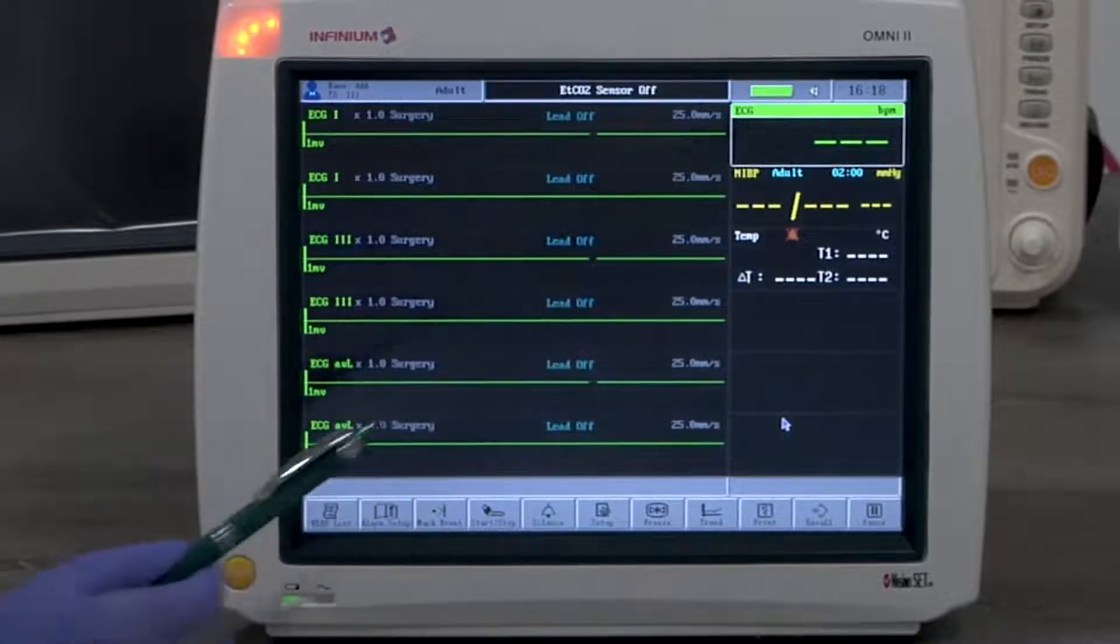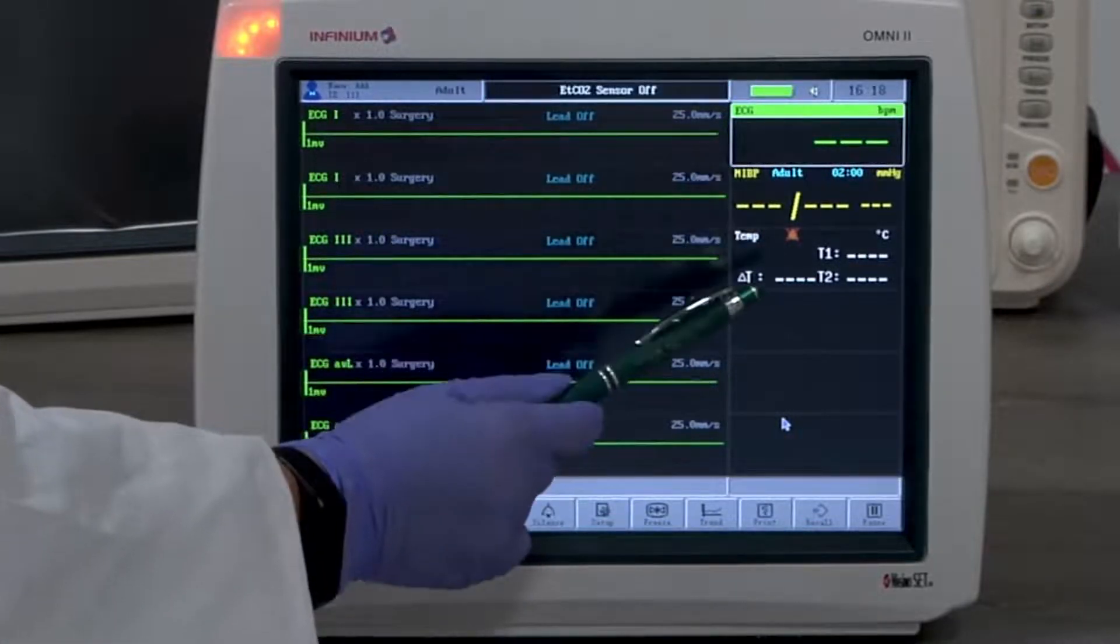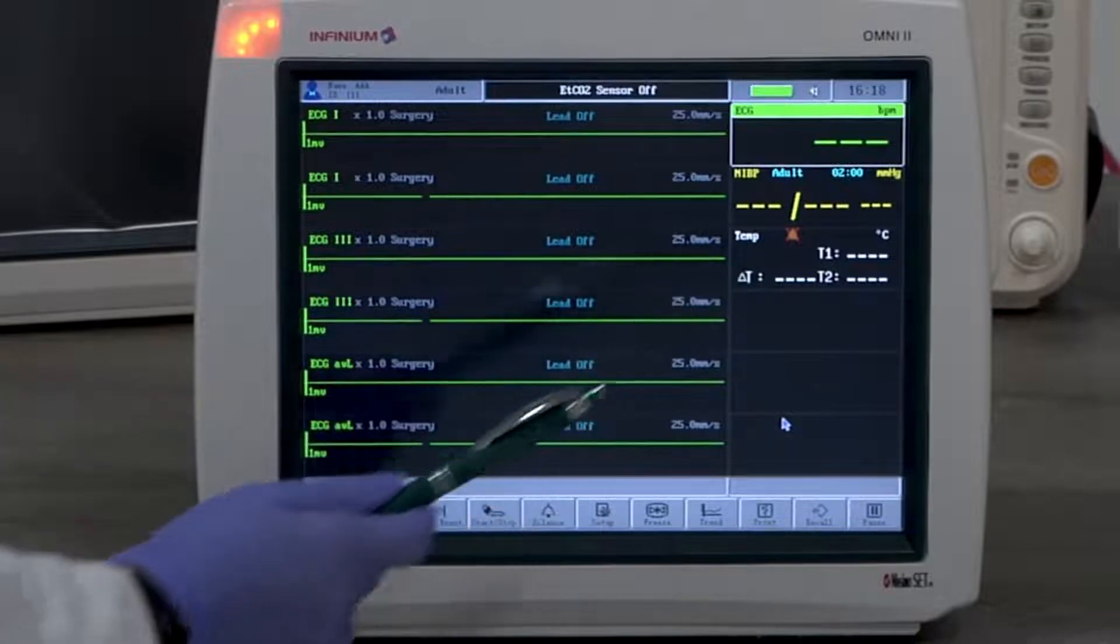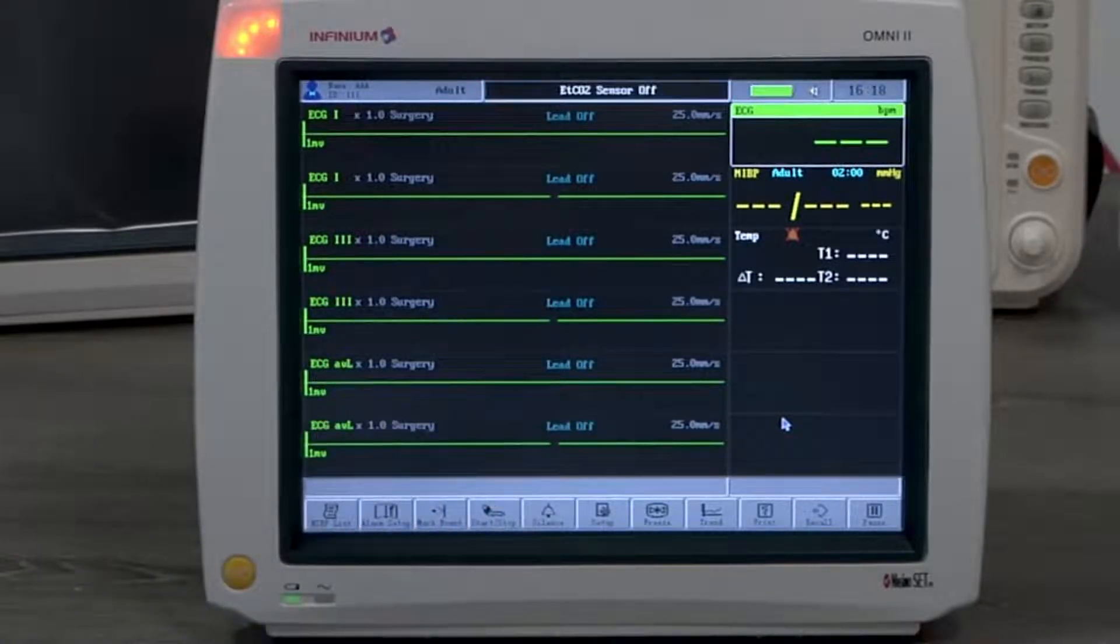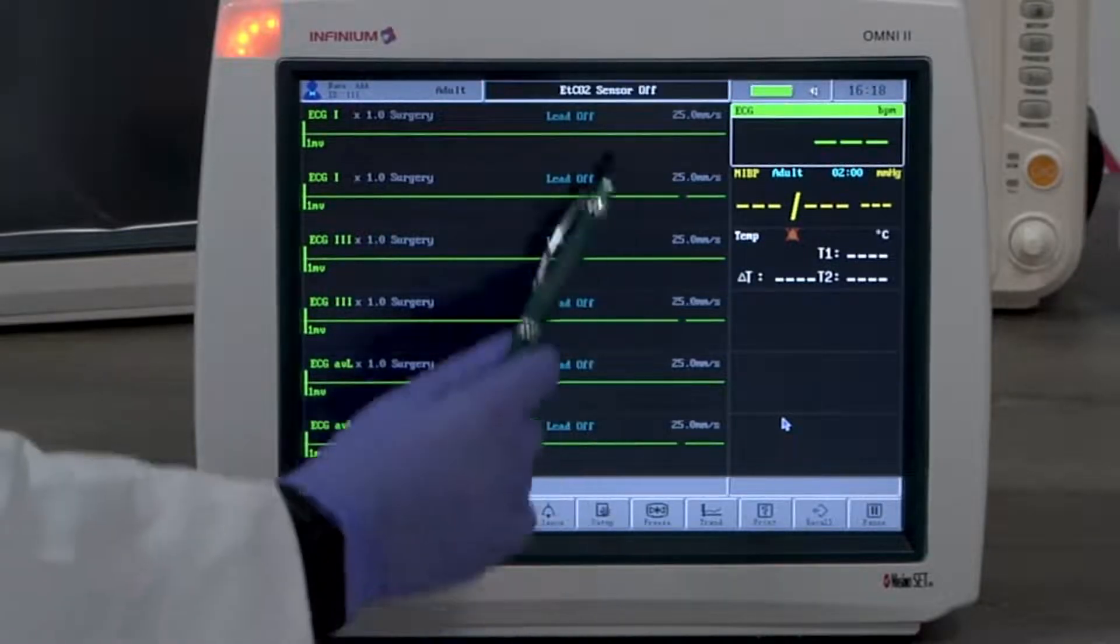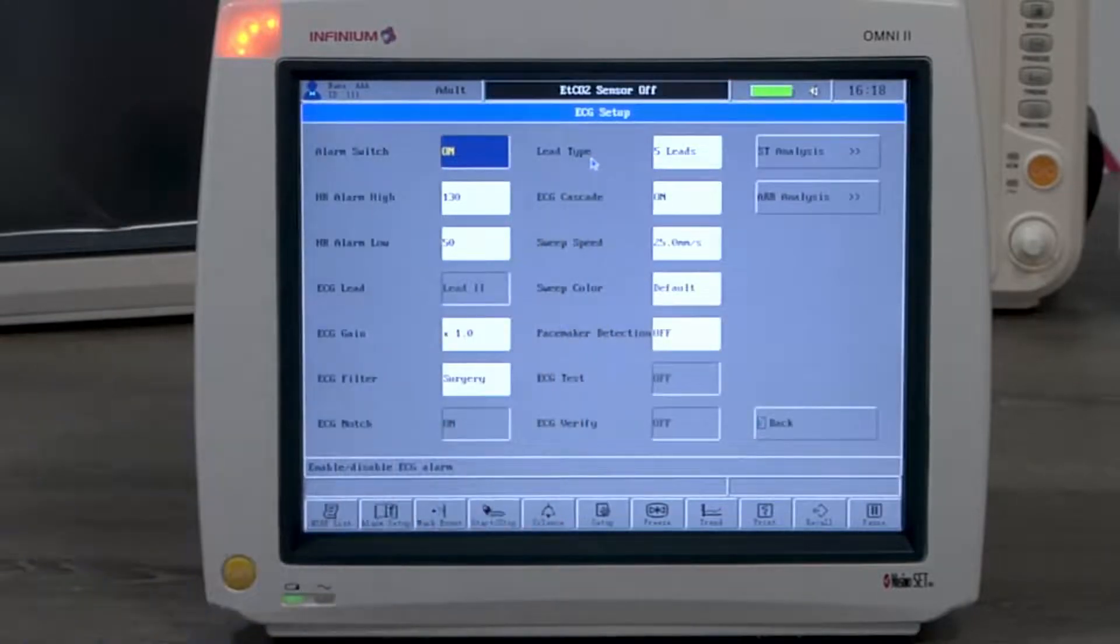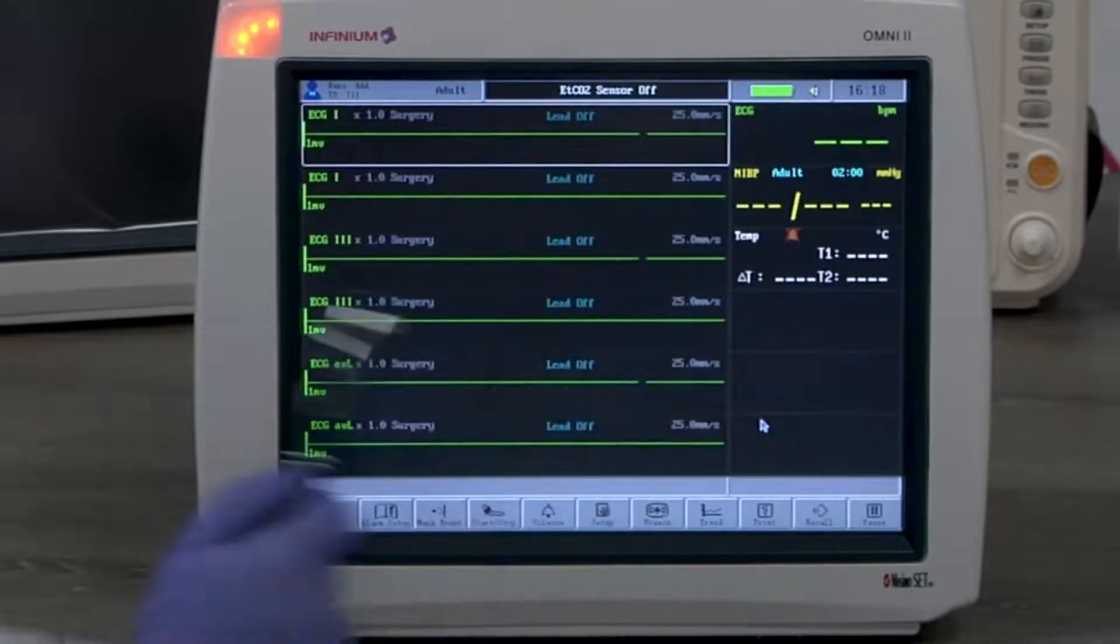The ECG cascade option, when turned on, allows you to select the same lead to be displayed on the next waveform channel. Let's look at what you would do when you need to see other waveforms.